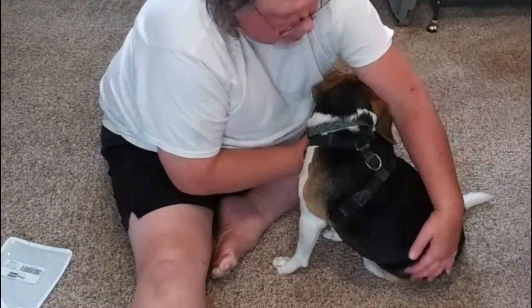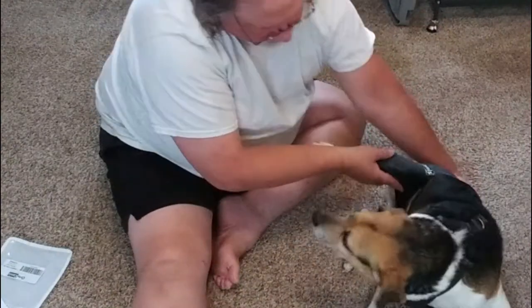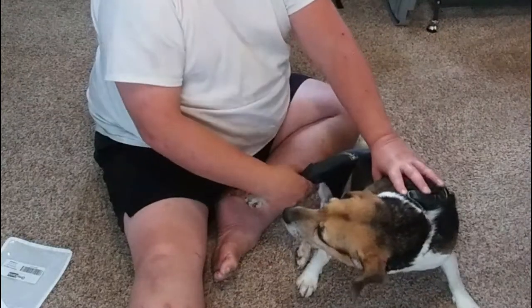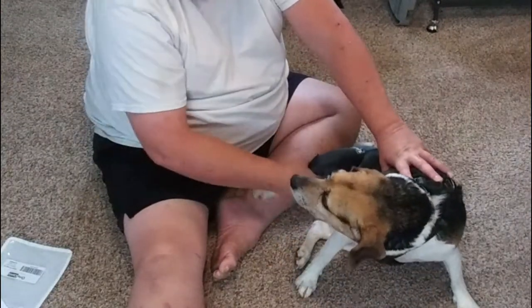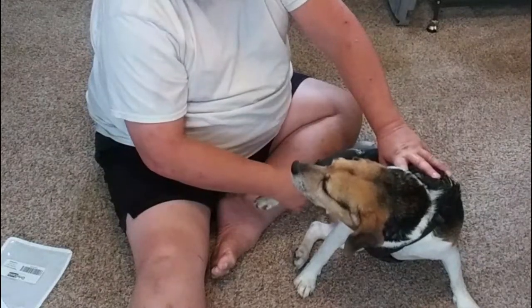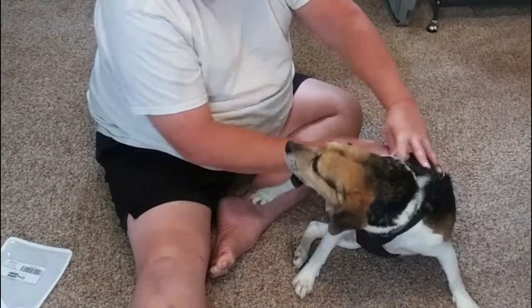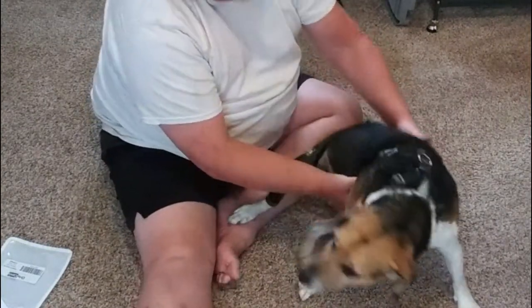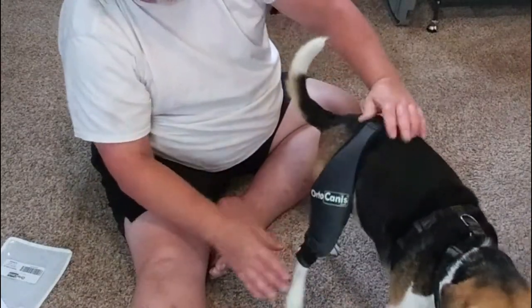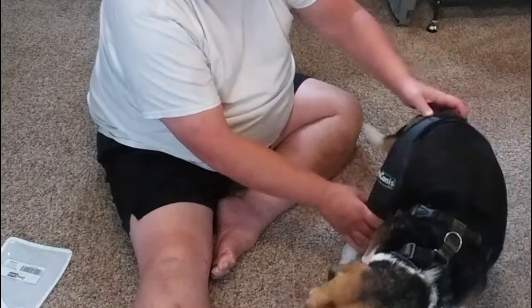Let's turn you around so everybody can see you. Okay, I got it on. The bottom straps are down here too. I got it somewhat snug but not overly tight. Hopefully he doesn't pee on it. Let's stand him up and see what it looks like — it could probably be a little tighter.